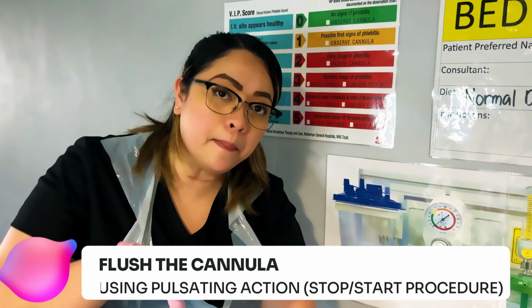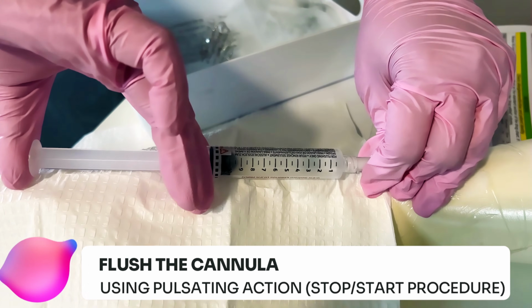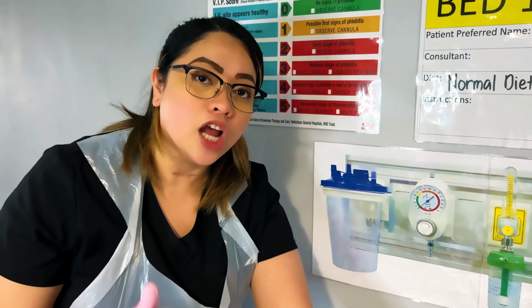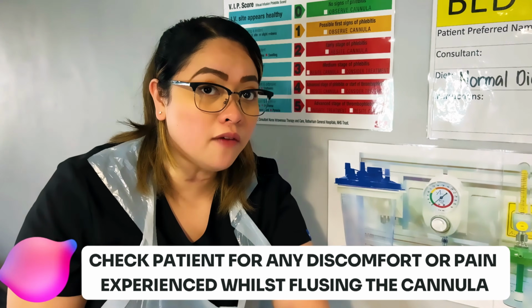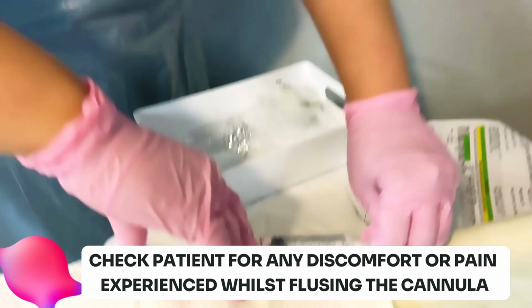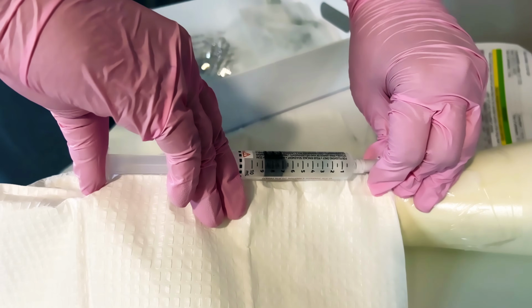Okay, now I'm going to start flushing the cannula using a pulsating action or a stop and start procedure. Start, stop, start, stop. Also, in this part, while doing the flushing, you have to ask the patient in between the flushing whether any pain or discomfort is experienced while flushing. Okay, again. Start, stop, start, stop. Are you okay?